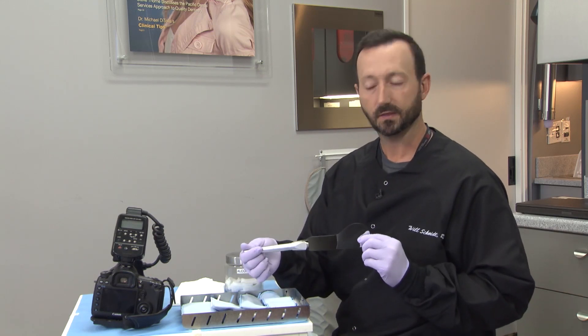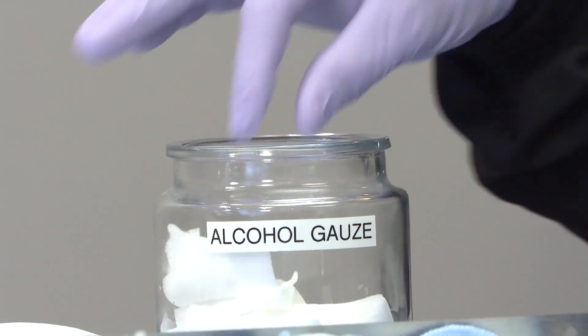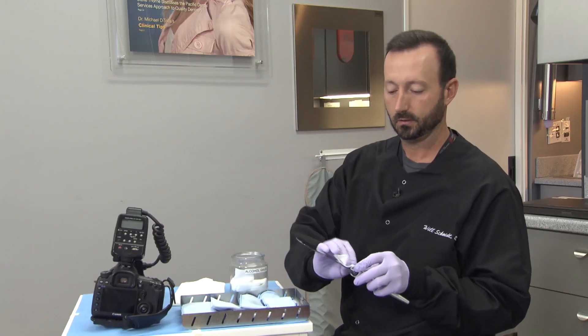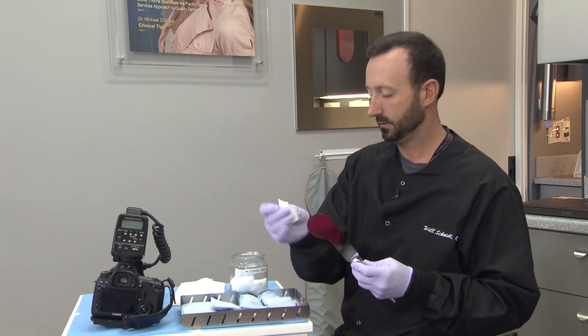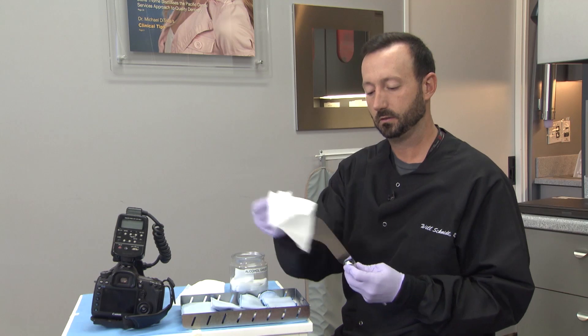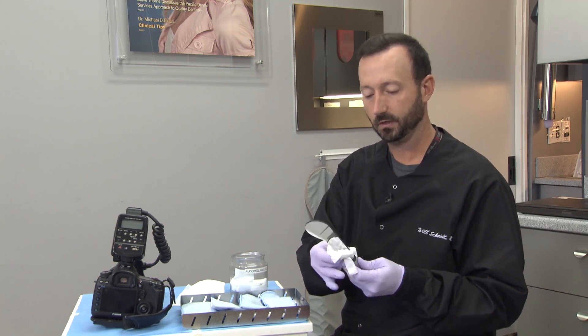Hold the mirror just like that. You can hold the mirror or your patient can actually hold the mirror as well. To keep your mirror clean, I just use simply an alcohol swab, and to clean and dry the tissue works just fine.